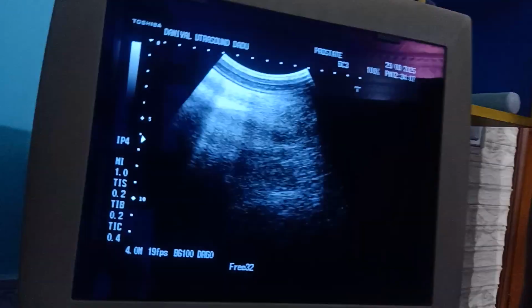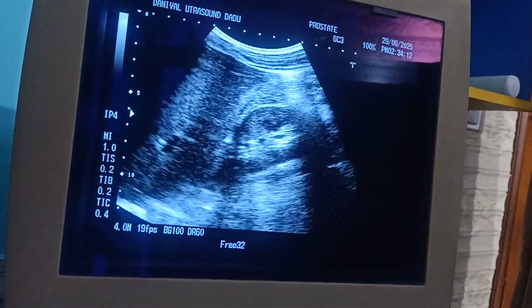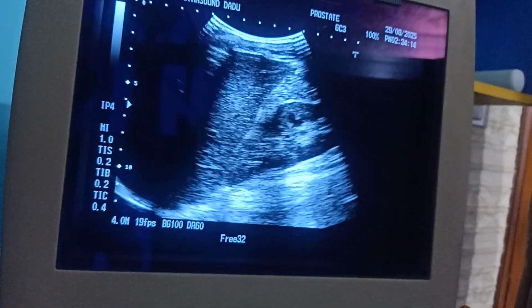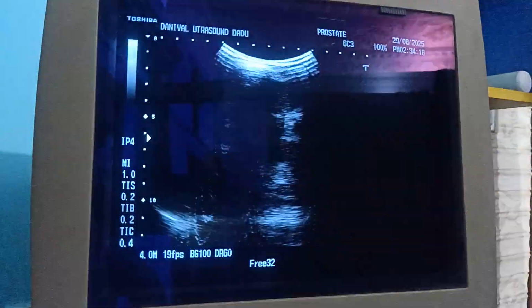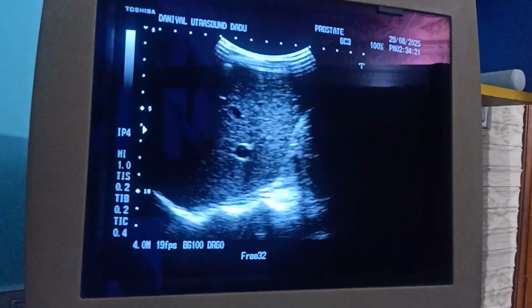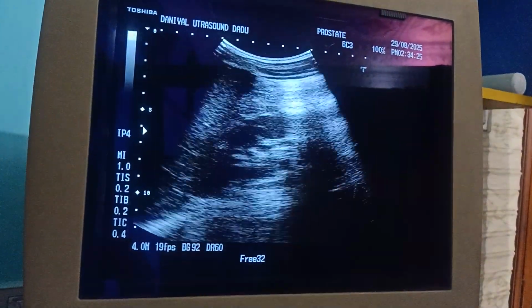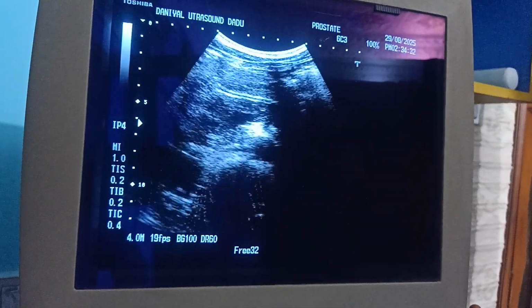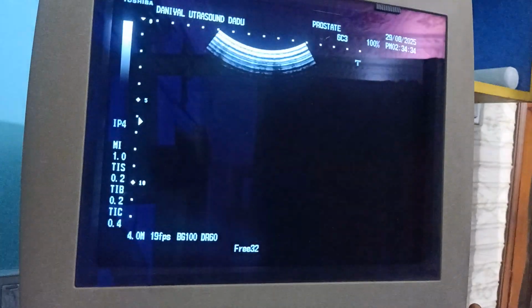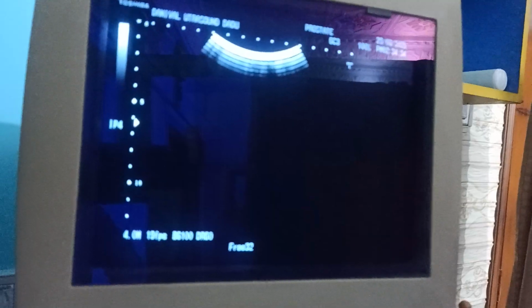Well, we have got a patient here who is complaining of vague abdominal pain with increased gut sounds. So on ultrasound, let's see. Here is the liver, which appears obviously normal in size and shape. This is right kidney. This is epigastric view. I'm just taking a bird's eye view, otherwise we'll go into details afterwards.